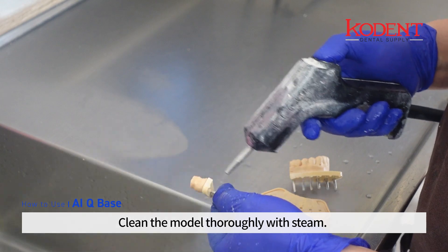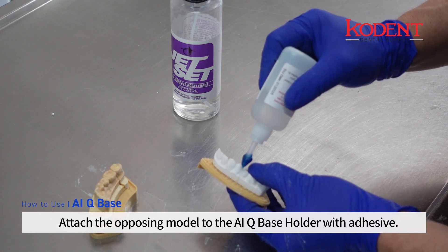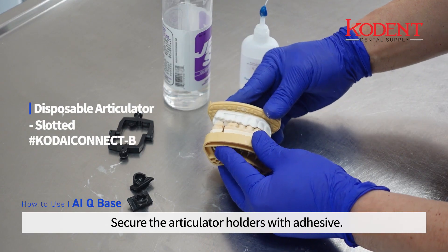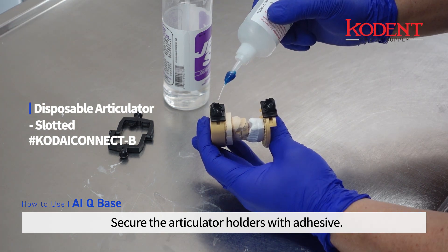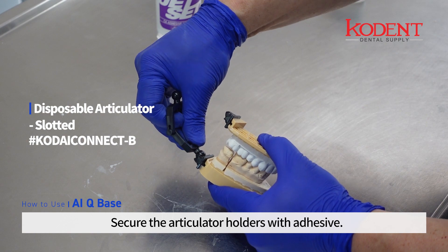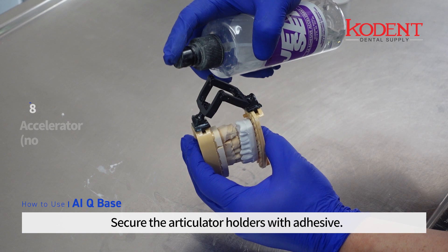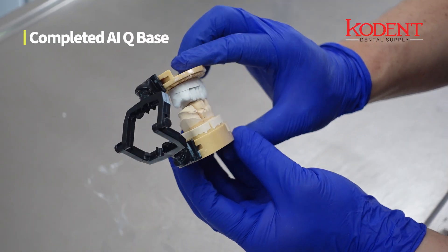Clean the model thoroughly with steam. Attach the opposing model to the AIQ base holder with adhesive, and secure the articulator holders with adhesive. This produces the completed AIQ base.